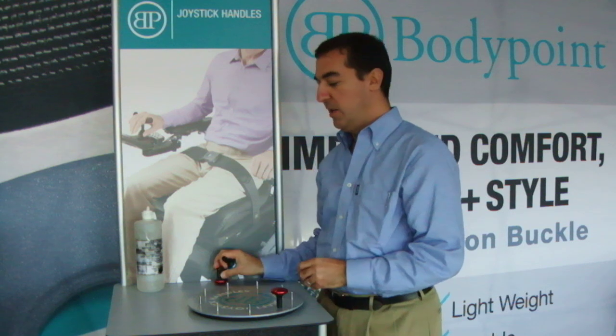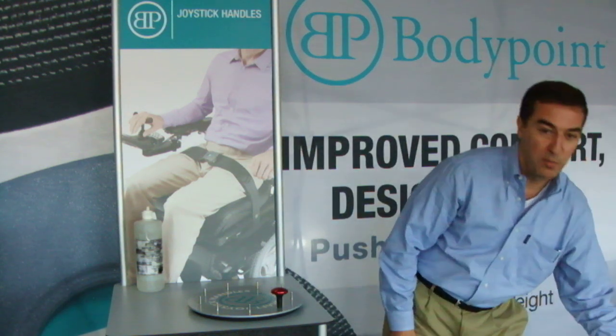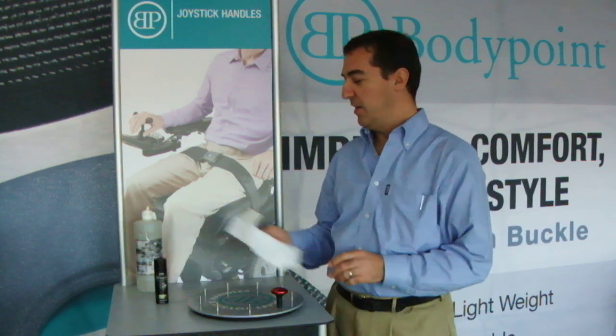But there are occasions when you need something even more secure than that, and there's a simple solution for that. All you need is a little bit of hairspray and a rag.